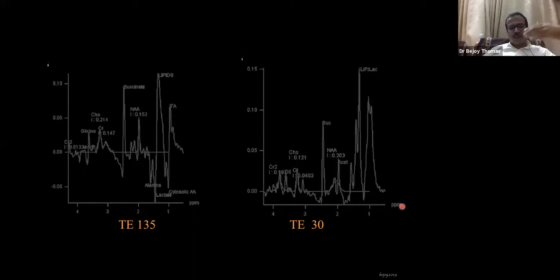That will not differentiate between an aerobic abscess and an anaerobic abscess. In aerobic abscesses, you see lactate and the cytosolic amino acids and a small amount of alanine and even glycine.